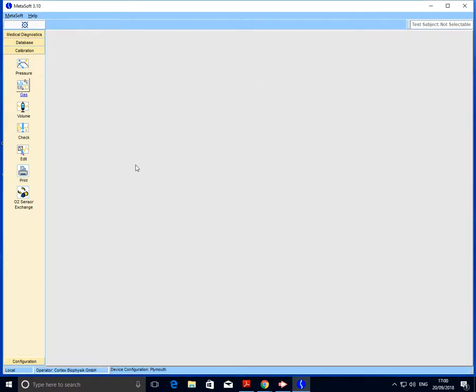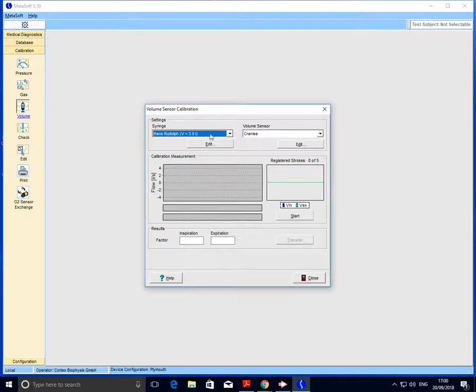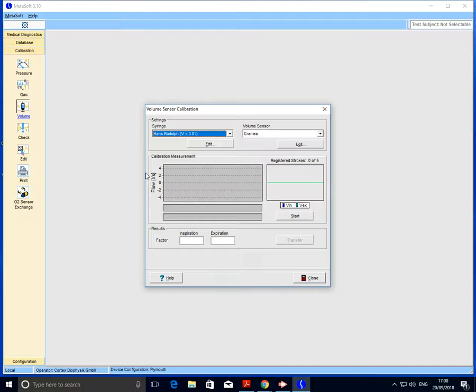The final part of the calibration is to calibrate the volume. We need to grab hold of the three-liter syringe and place into the end of that the assembled turbine. You'll notice that on the turbine there's a slight hole, and the idea is that we plug that hole with the sample line.